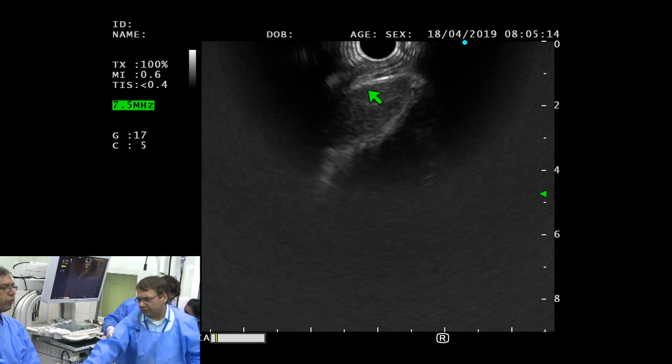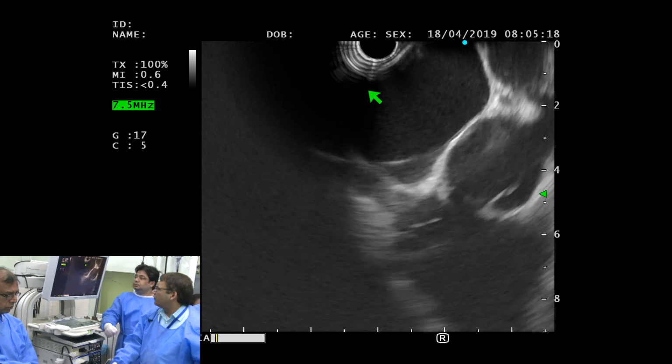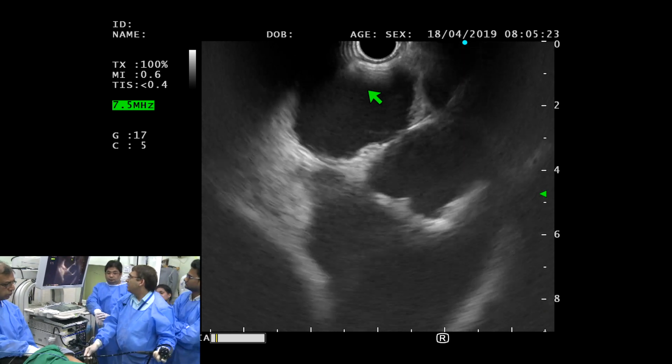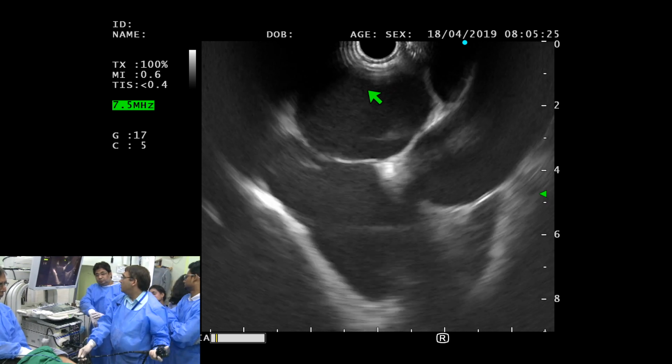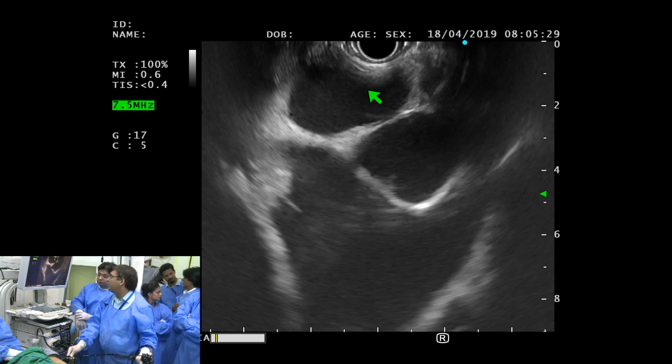With regard to the mediastinum, you don't have to do anything really major. Just bring the scope close to 30, most of the time, not always, depends on the patient's height. When you are at 30, the left atrium comes towards you, with the scope still in neutral position. You see the left atrium right there.